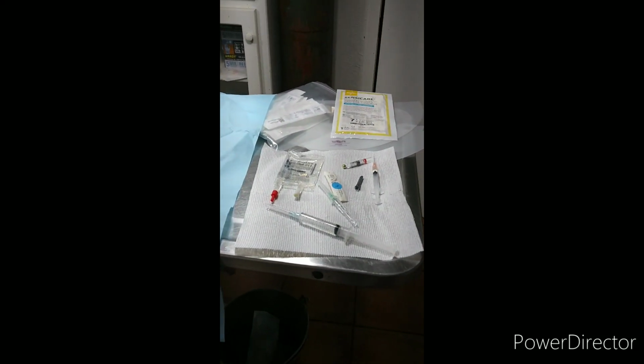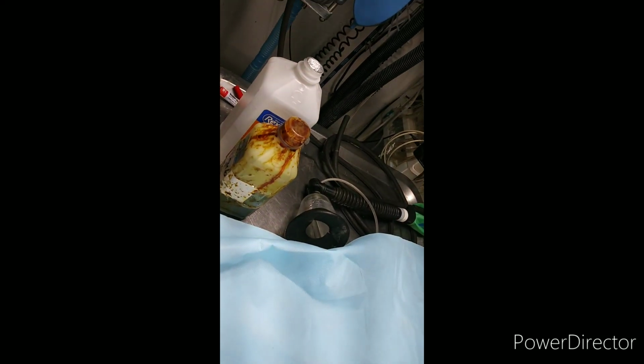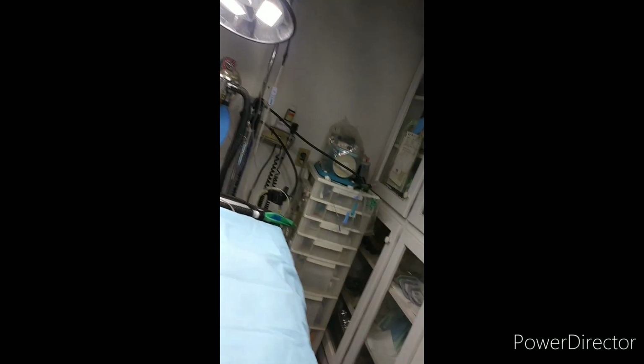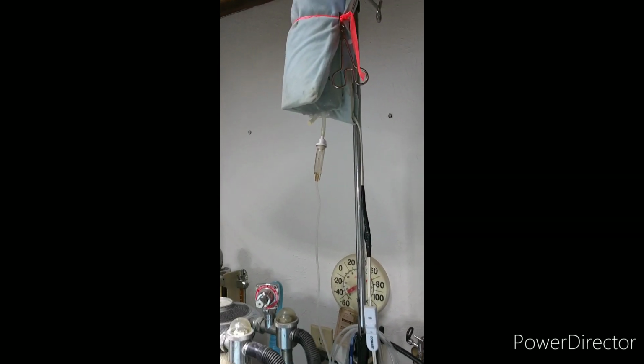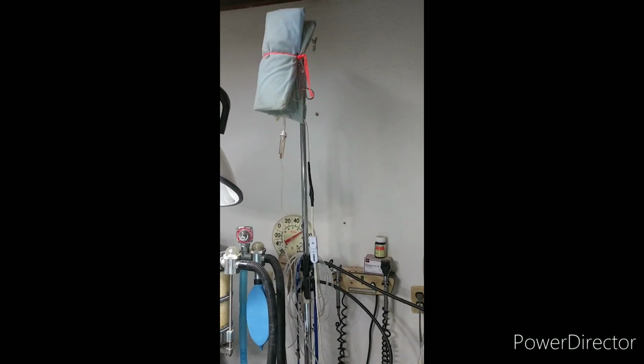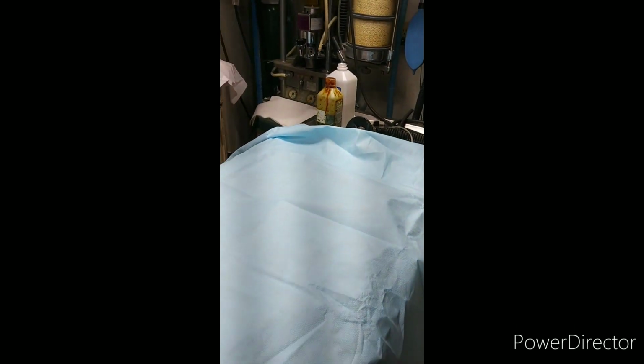I'm getting set up for Munchie, 16.5 pounds, 9-year-old tomcat catheter. He is obstructed. I'm heating his fluids right now. His bladder is the size of a grapefruit.